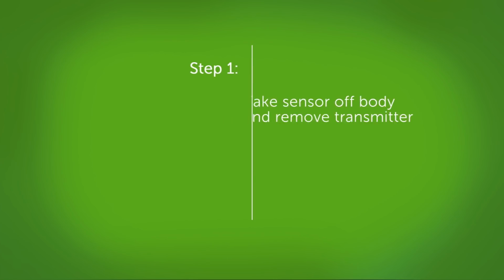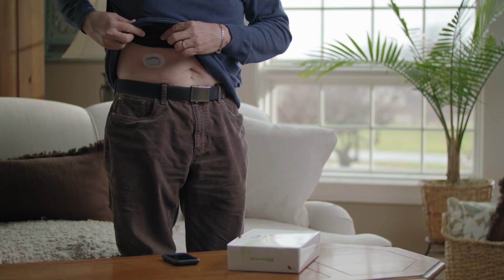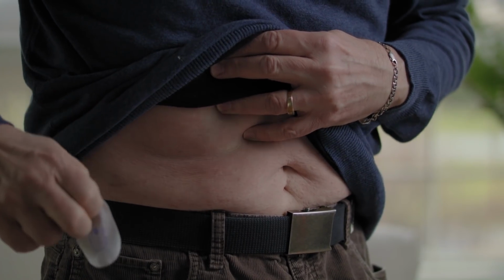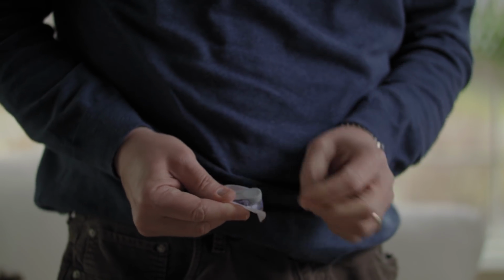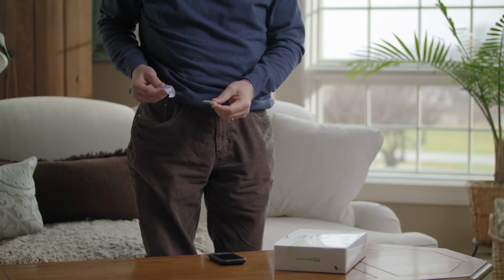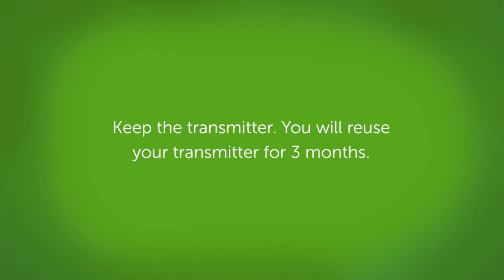The first thing you need to do is remove your sensor and transmitter. Grab the edge of the adhesive patch, peel the adhesive and the transmitter up and away from your body like a bandage. Next, you need to remove the transmitter from the holder. To remove the transmitter, push down the lip and break the wide end of the transmitter holder. Pull the transmitter out of the holder. Keep the transmitter to use with your next sensor. You will reuse your transmitter for 3 months.